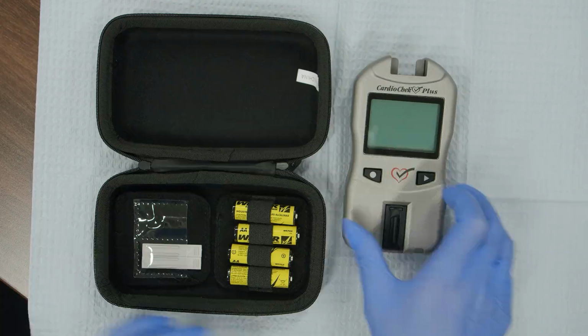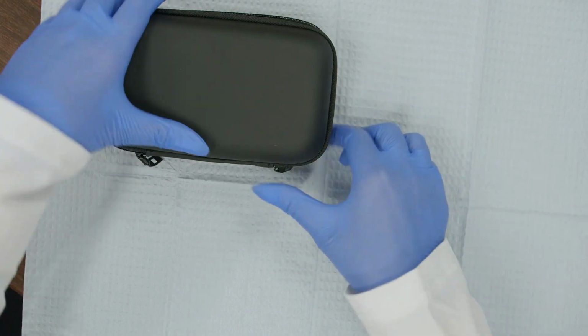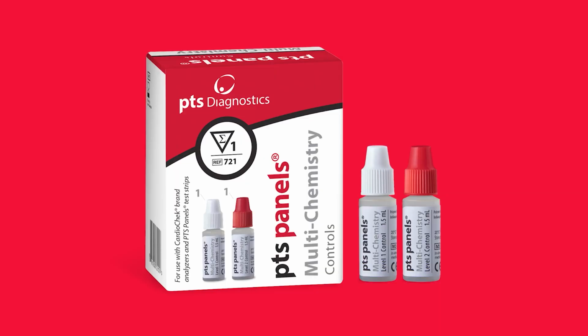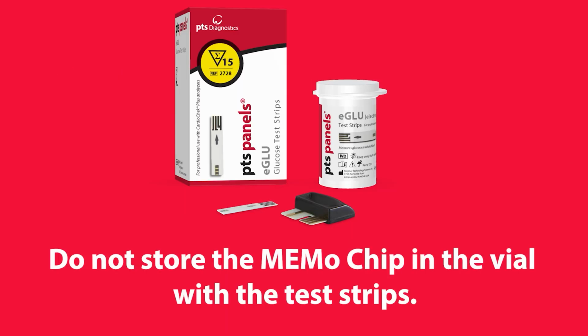Proper storage and handling helps protect the performance and longevity of your analyzer. Store the CardioChek Plus analyzer in the case provided at the temperature indicated in the user guide. Store the PTS panel's control materials and test strips at the temperatures indicated in their package inserts. Store the memo chip in the box with its original lot of test strips. Do not store the memo chip in the vial with the test strips.